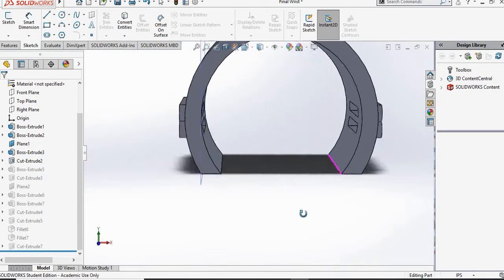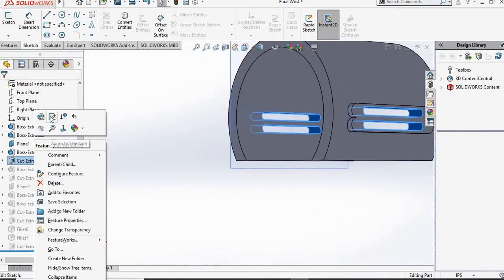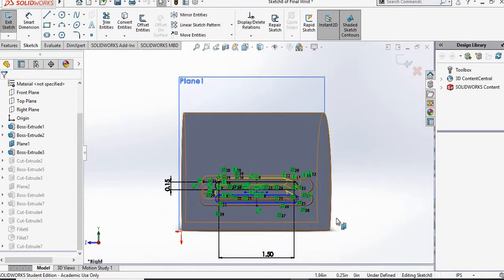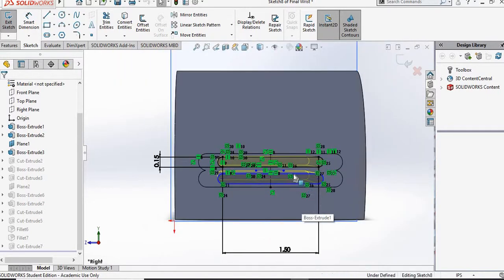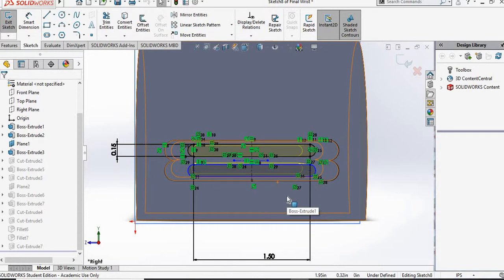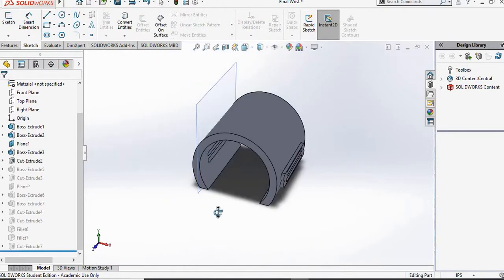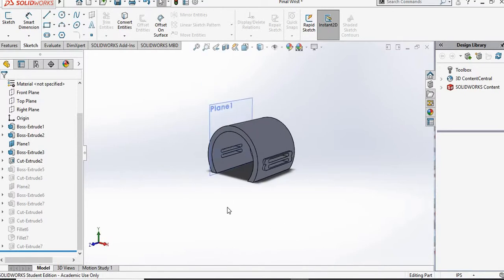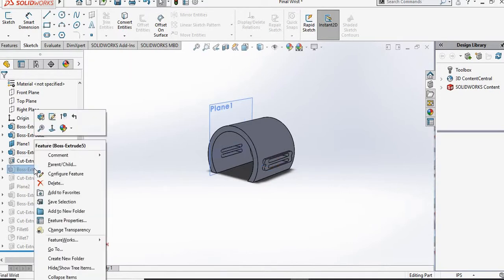Again, here you see I made the cuts with the following dimensions. Go ahead and show you that. And it's basically just lines and arcs as well. Again, those are the dimensions, 1.5 and 0.15. Alright, so after creating these holes for our Velcro straps, I went ahead and created the attachment pieces, or the attachment extrusions so it can attach to the palm.